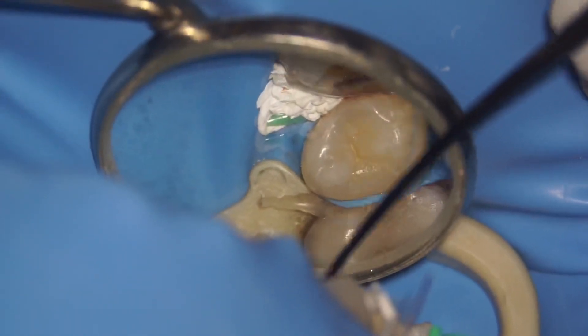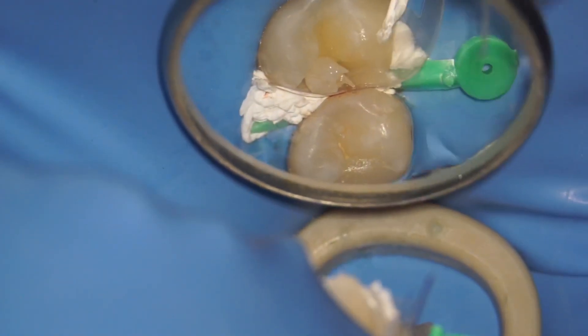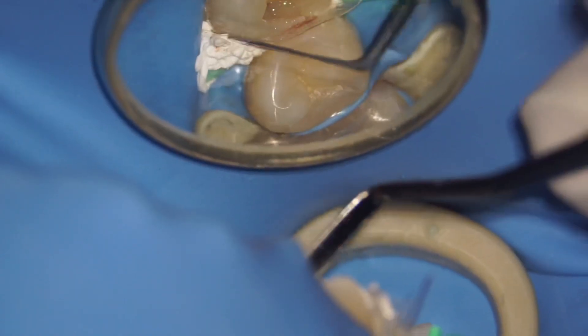Before we start, I'm going to place a bit of flowable to make the margin leak-proof. For this case, I'm going to just build the palatal half of the distal wall first. I'm adapting it well — only the palatal half — and using my plastic filling instrument to adapt the matrix well so that I don't have any excess.